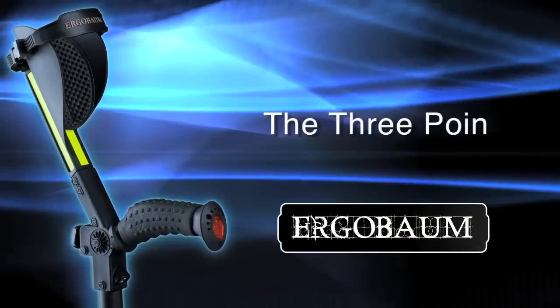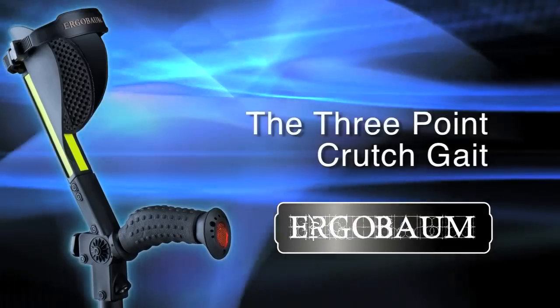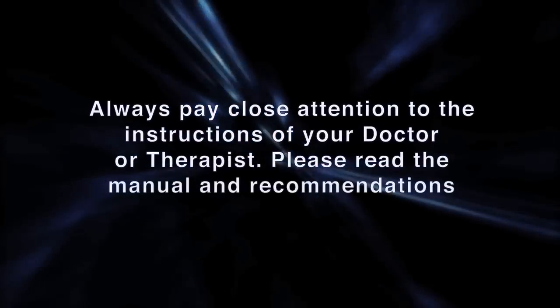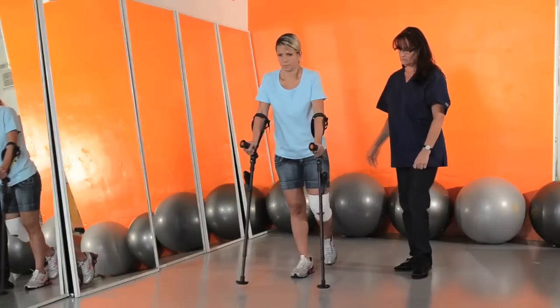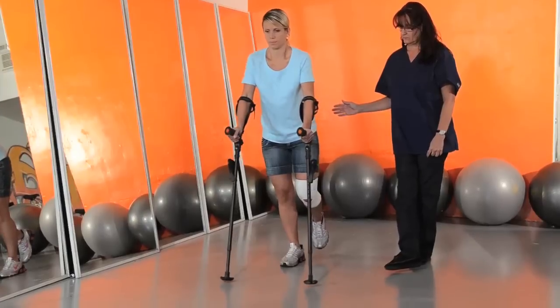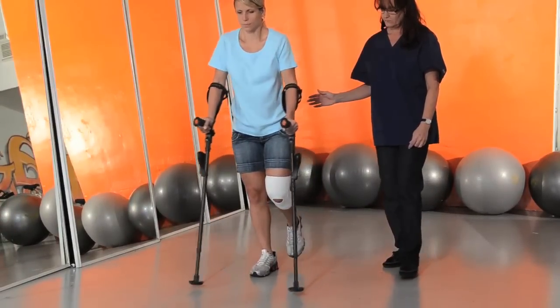The three-point crutch gait. This type of gait is used where there is incapacity to place weight or pressure on one of the lower extremities, i.e., bone fracture, injury, and/or amputation.